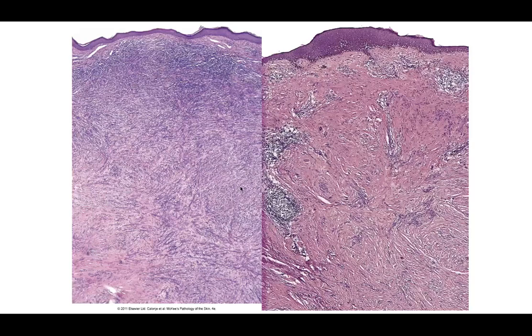Here's another example of just how it looks almost like diffuse lymphoid aggregates on low power. And you can see that in some cases there is very fibrotic desmoplastic stroma, which is a part of the definition, obviously. You can see here on the left, mid-left side of this right panel, this diffuse, what appears to be a lymphoid aggregate that I was talking about. So often seen in desmoplastic melanoma.